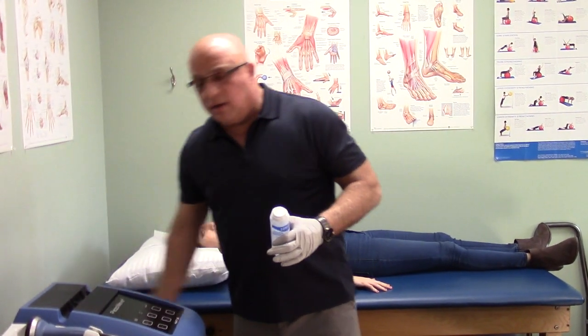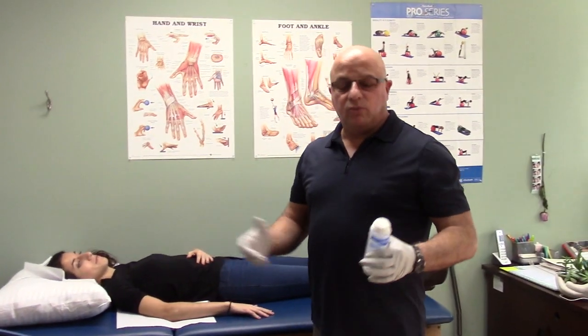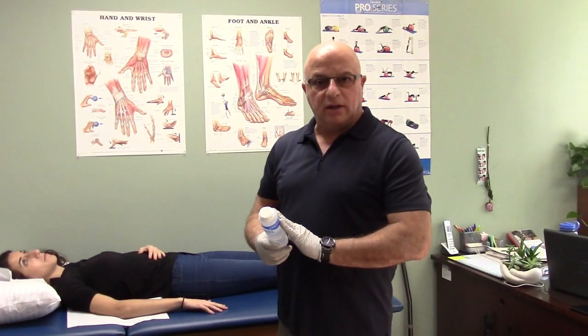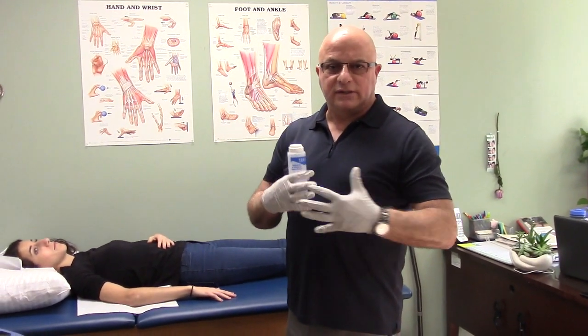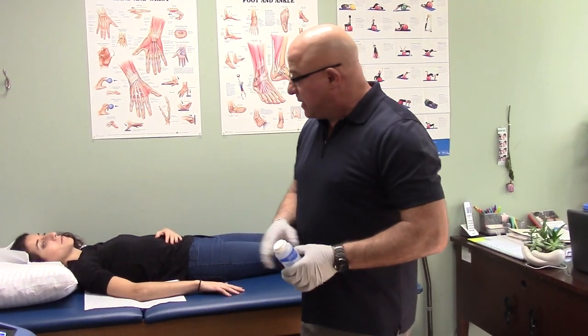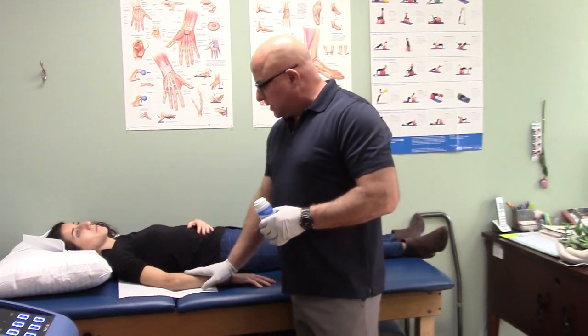Just like an ultrasound, what we want is to use gel — ultrasonic gel — for conduction and better utilization of the sound and effectiveness. I have the patient exposed with the elbow.